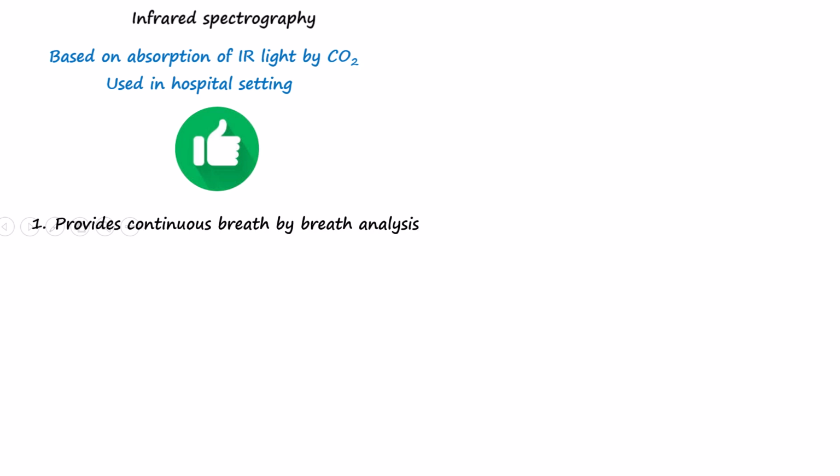Unlike the colorimetric method, infrared capnography provides continuous breath-by-breath waveform analysis and offers the benefit of continuous monitoring, and it is quantitative too. This helps assess the patient's airway status and the effectiveness of ventilation. These monitors are sensitive enough to detect very small amounts of CO2 in exhaled gas, even when the concentration is less than 1%. So they are capable of accurately measuring CO2 during CPR.